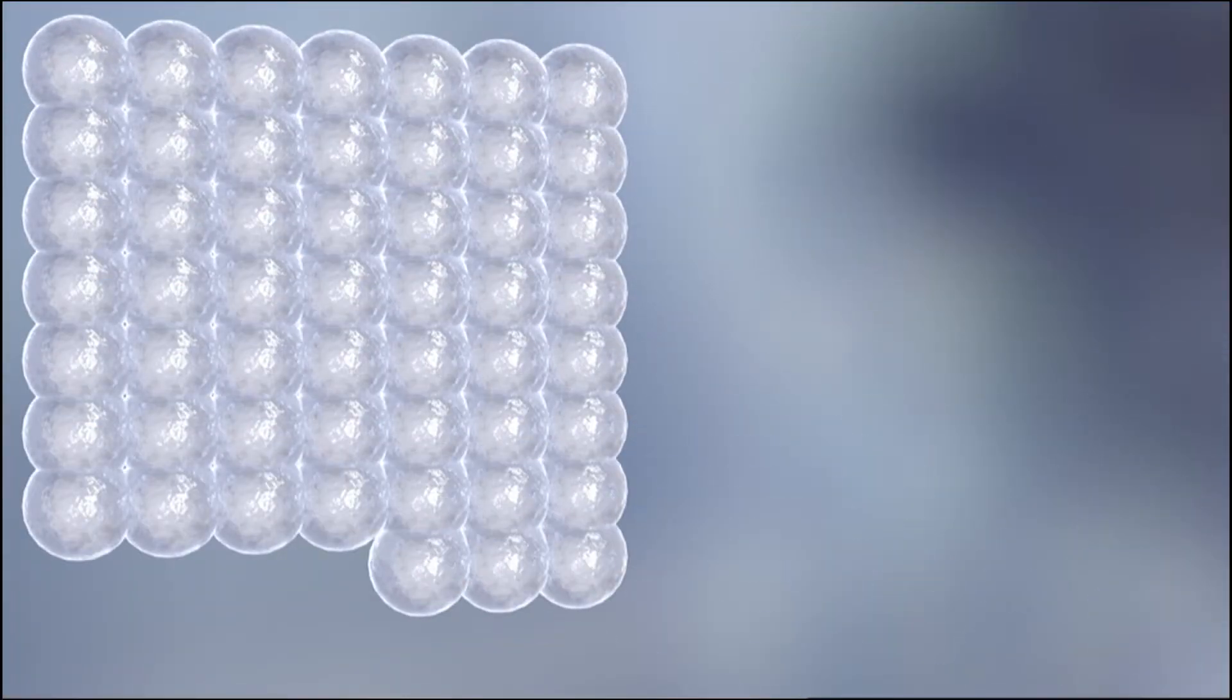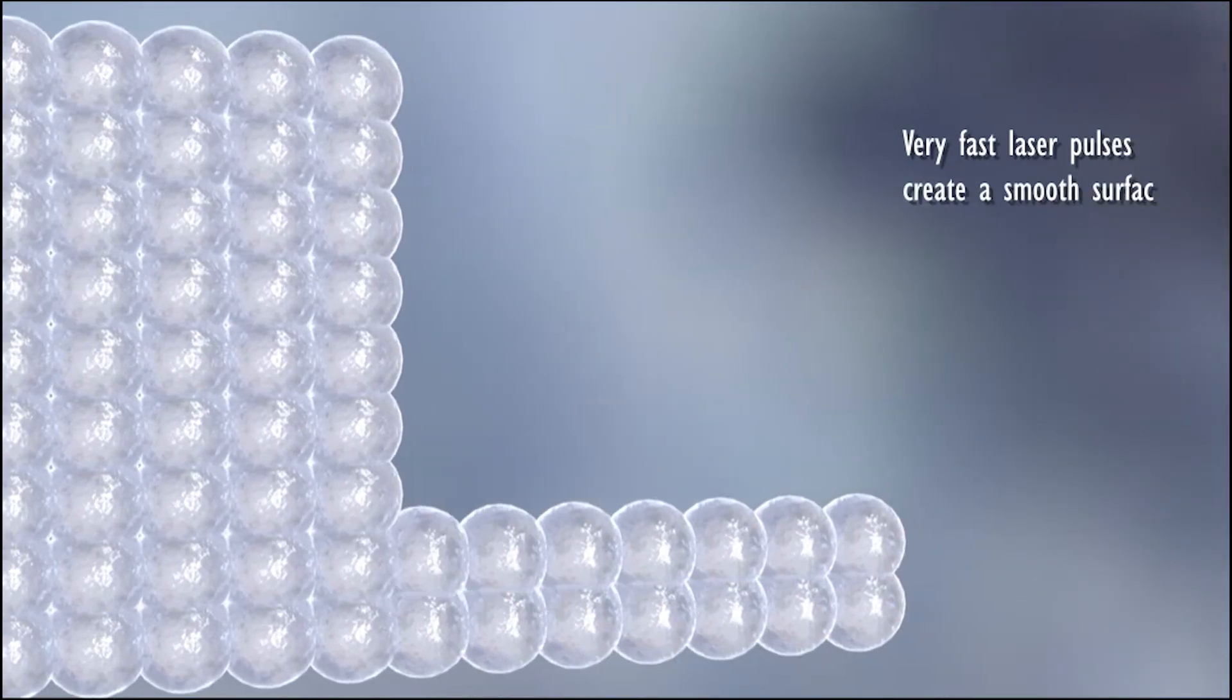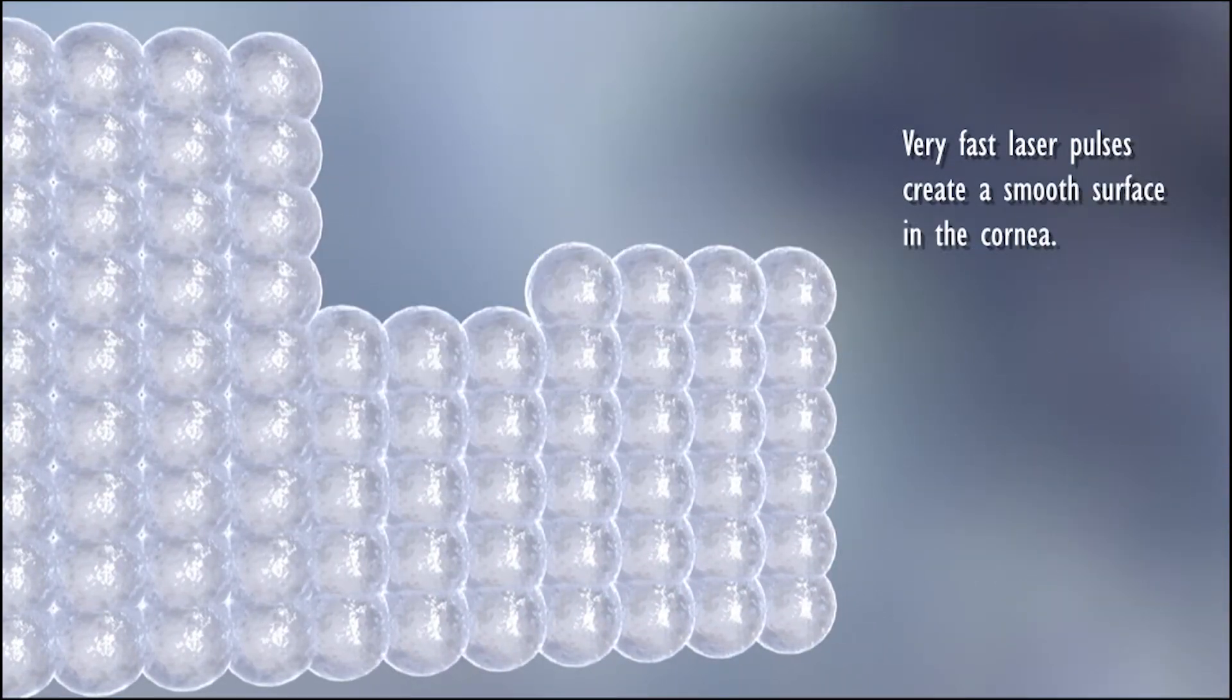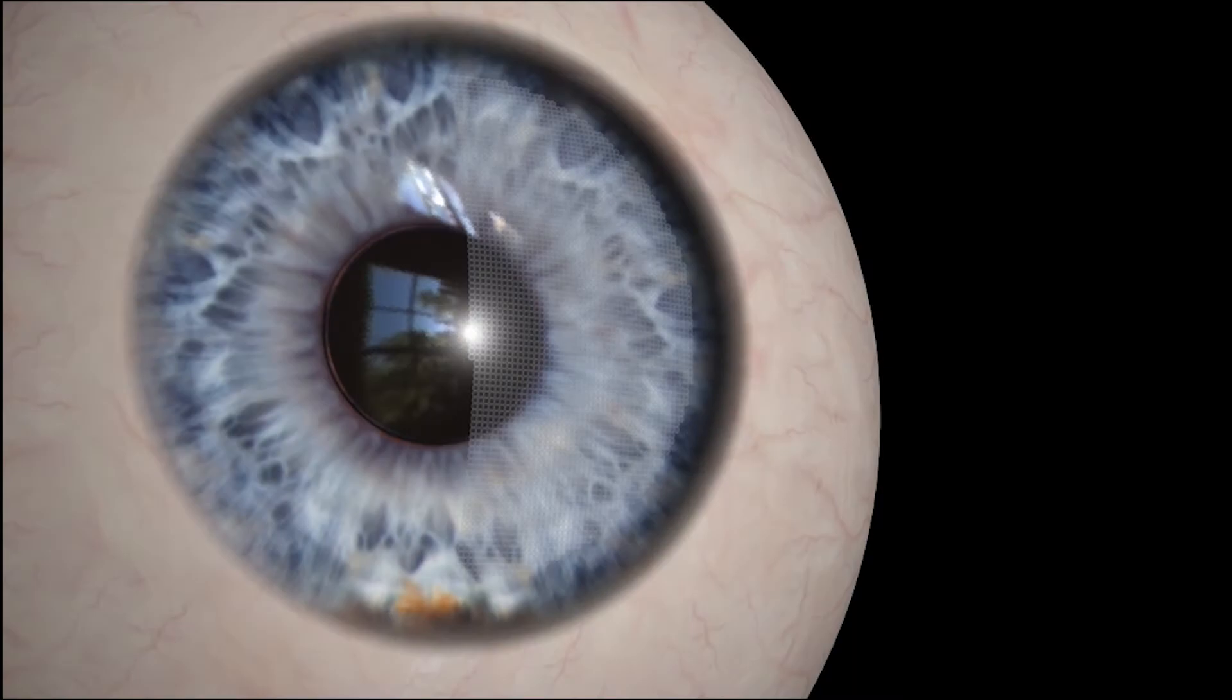With its extremely high frequency of pulses, the femtolaser separates the layers of the cornea in only a few seconds, creating an ultra-thin flap.